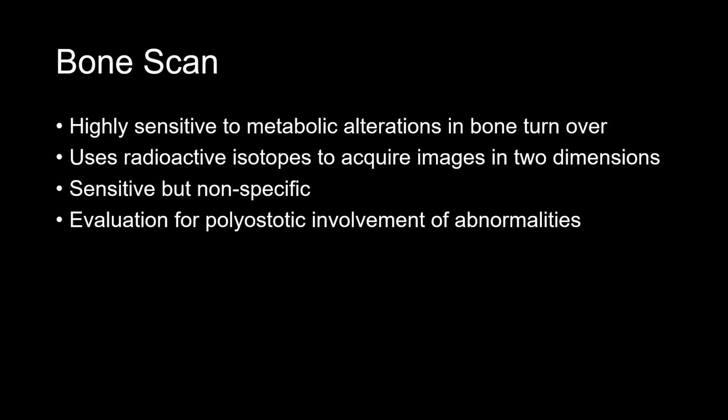And the reason why this is helpful is it allows you to determine where there's high blood or metabolic activity at a certain site. And that's valuable with tumors because cancerous tumors tend to attract a lot of blood, need a lot of blood because they're growing so quickly. So it kind of creates a hotspot, so to speak, within the image.